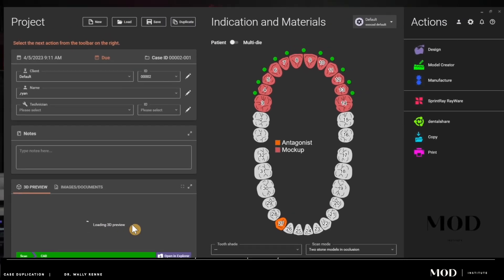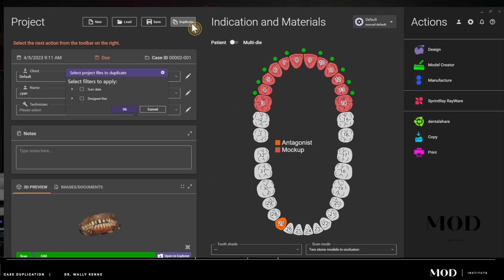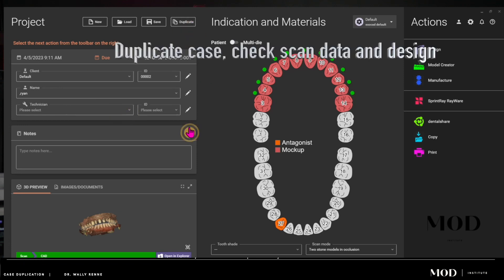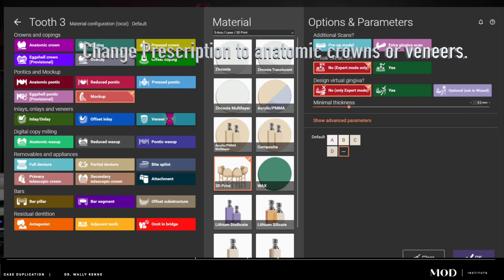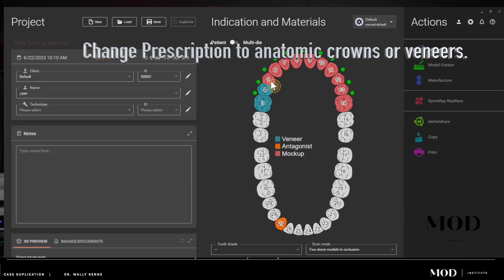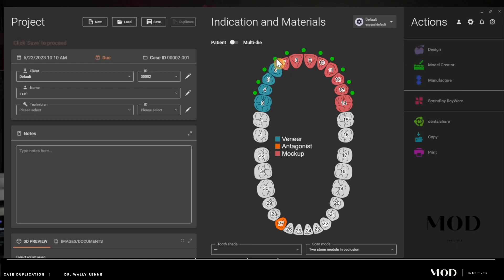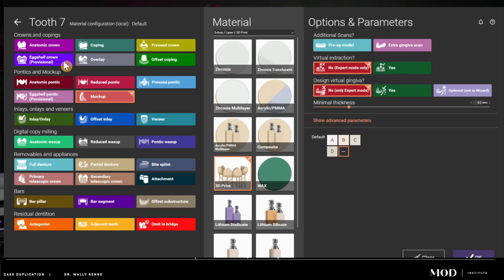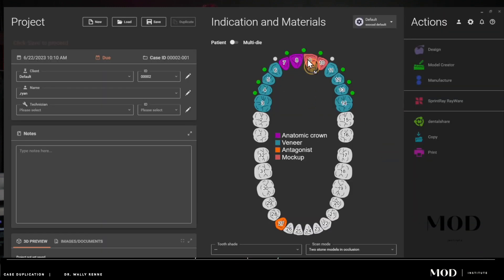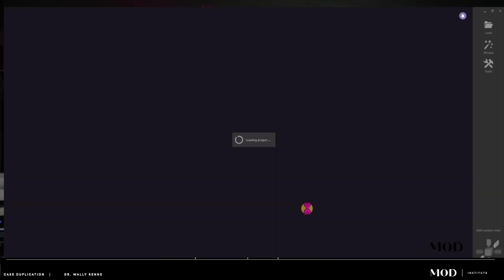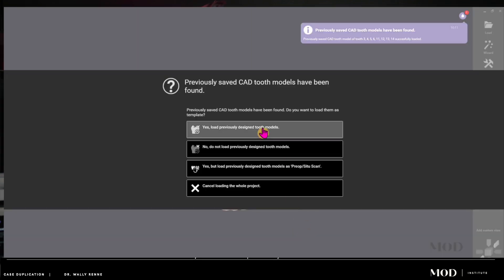Now with those files in place, you can see them pop up alongside my prep scan and bite. What's really cool is I can duplicate the case and hit 'scan data and design files' to duplicate it. I'll change the prescription: veneers on the molars and premolars up to the cuspid, connecting them for one temp segment; then the other segment as veneers connected; and then crowns on the anteriors, since those were crown preps on endodontically treated teeth. I'm going to 3D print, giving me three segments of provisionals.